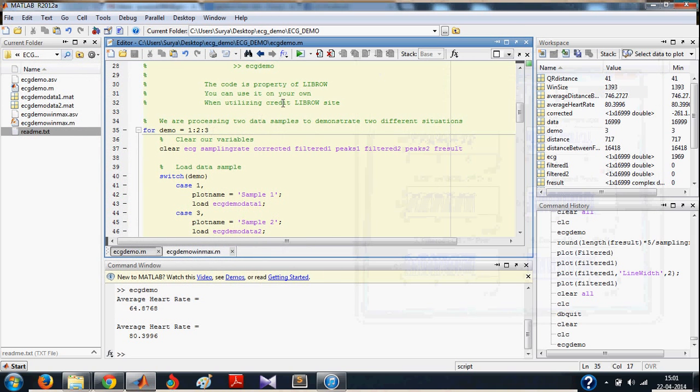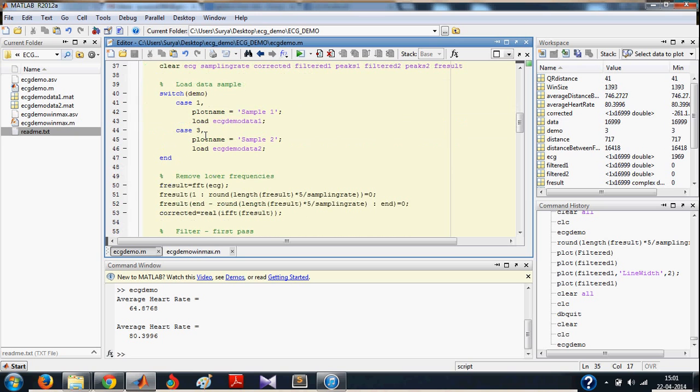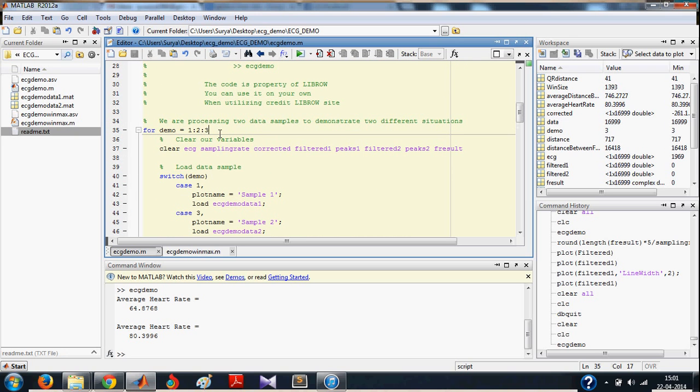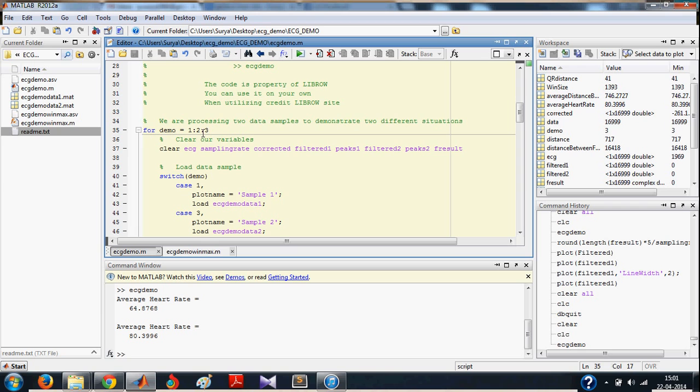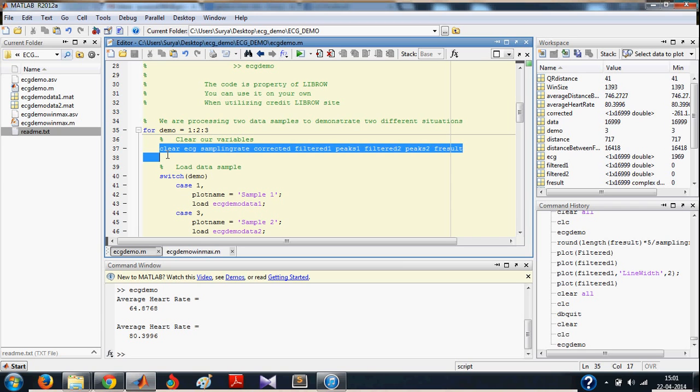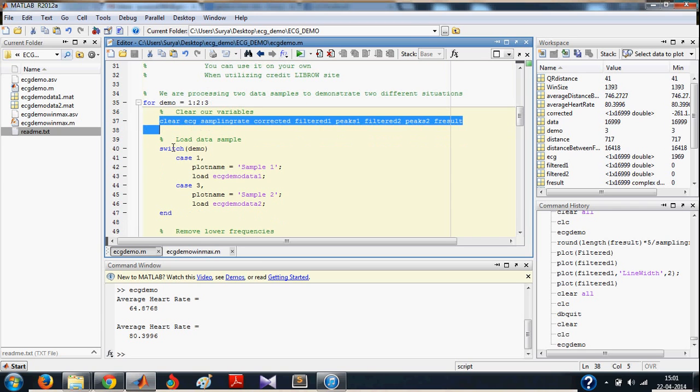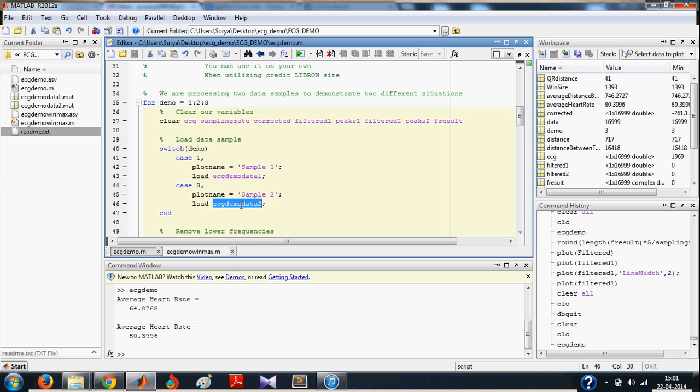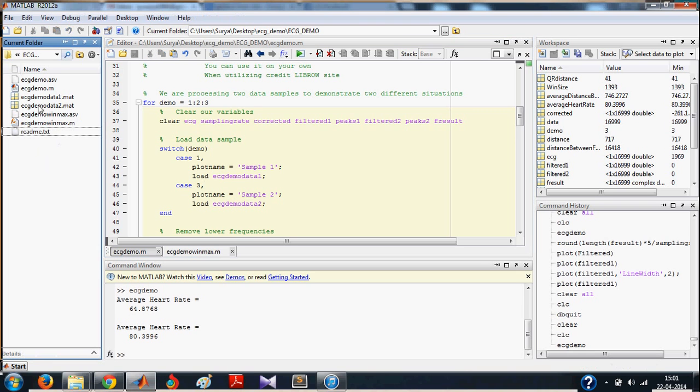So let us understand the code by keeping breakpoints at specific locations. Our code works like this: for demo equal to 1 in steps of 2 until 3, which means your loop runs for demo equal to 1 and demo equal to 3. First, you clear all variables. Then, when the value of demo is 1, you load sample data 1. And when your value of demo is 3, you load sample data 2.